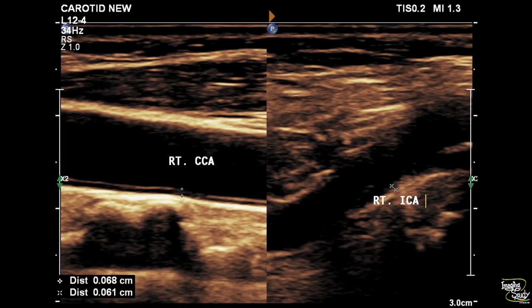Let's start with the right carotid system. The intima-medial thickness or IMT of the right common carotid and internal carotid arteries looks to be within normal limits.